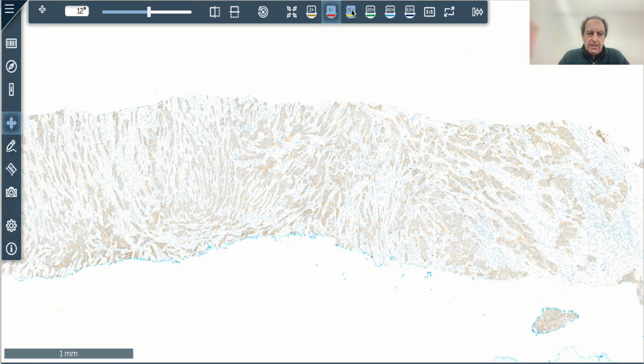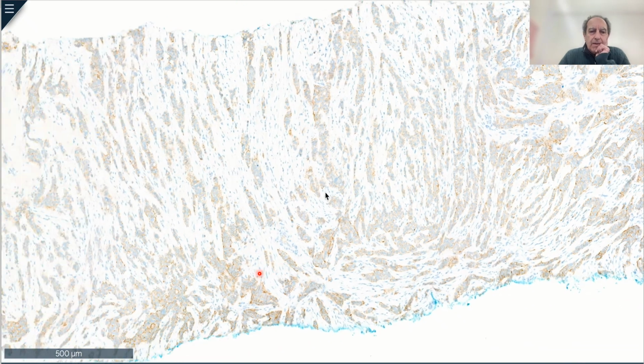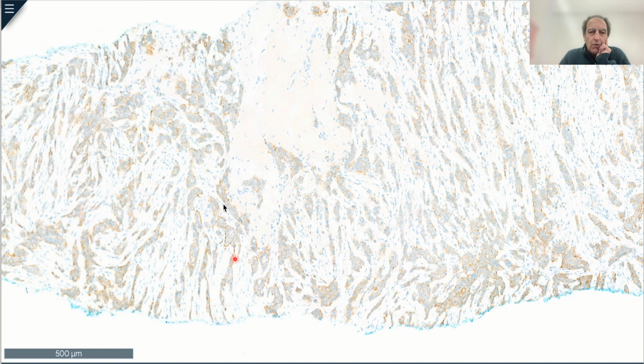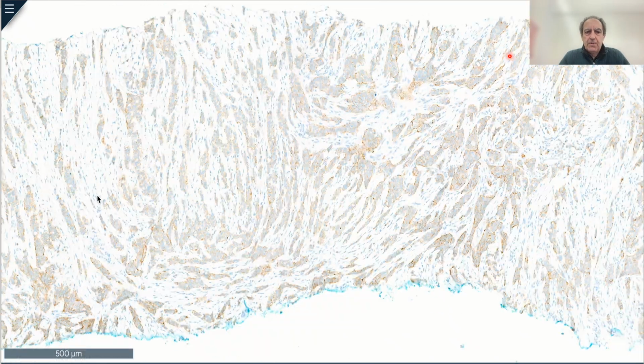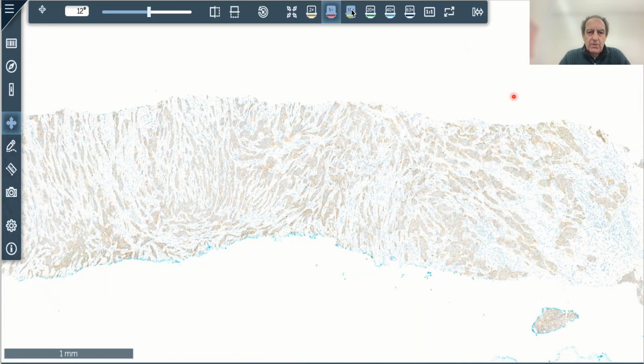So we engage the next power in the microscope. This is times 10, and now we start to see lines appearing on the screen. There seems to be incomplete staining, and not all the cells seem to have membrane staining. We look carefully whether there are areas where there is more abundant staining.